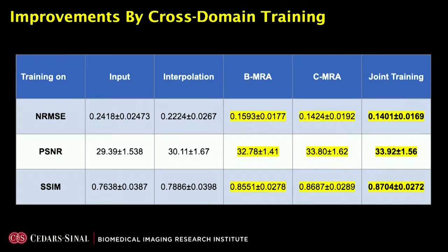And we also compare those numbers in training with only the coronary data or training only on the brain data or in the joint training, and we have seen the best performance with the joint training.